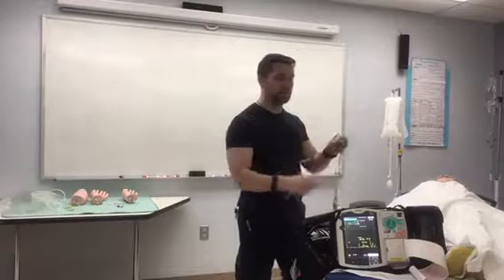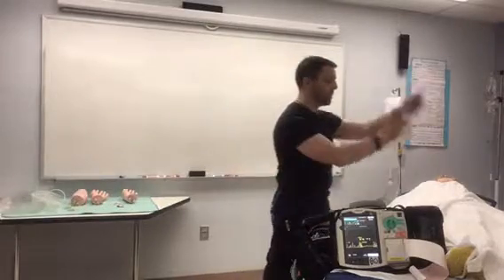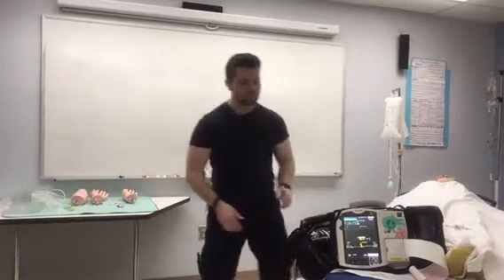All this data is available to us. So what it's showing is the difference, and we're looking at the waveform of the difference. Well, we want to have an accurate depiction.